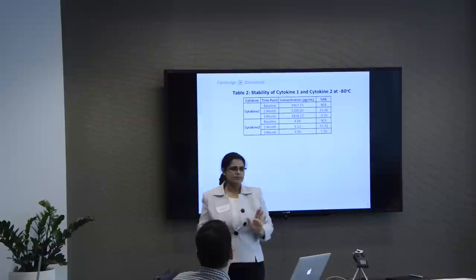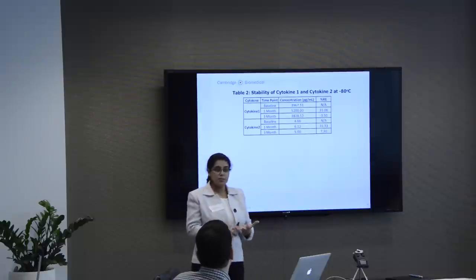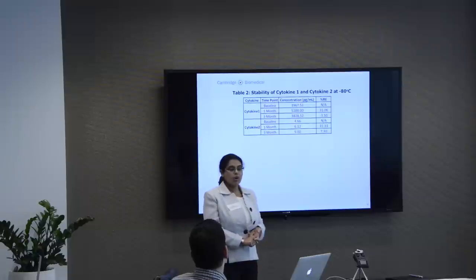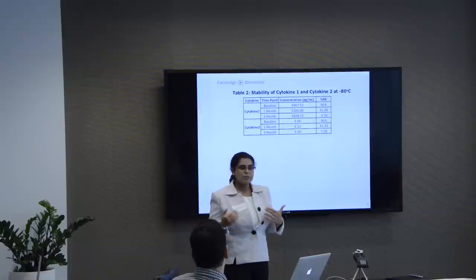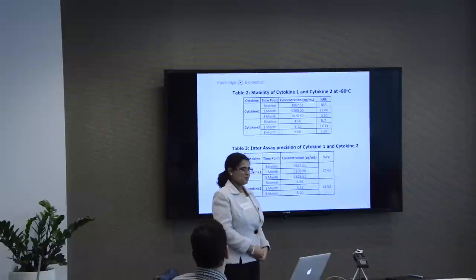So what do you do? Report the sample being unstable at 1 month, stable at 3 months, not use the data at 1 month, or continue a stability study? Take the sample as stable? How do you know it's not the kit itself?